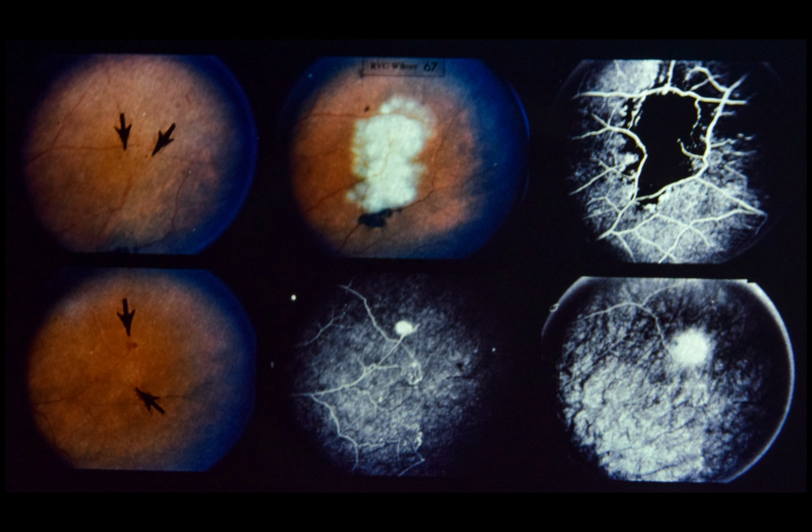Upper left is an area of retinal neovascularization in the nasal periphery of the right eye. To prevent vitreous hemorrhage, this area of neovascularization was closed with high-intensity argon laser photocoagulation, upper center. 1 month following treatment, a fluorescein angiogram, upper right, shows no filling of the obliterated neovascularization.